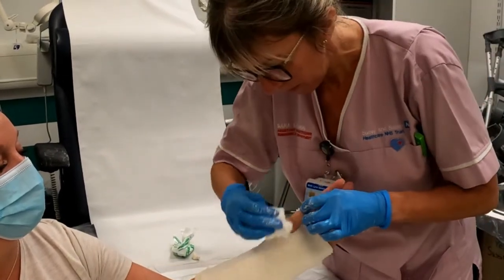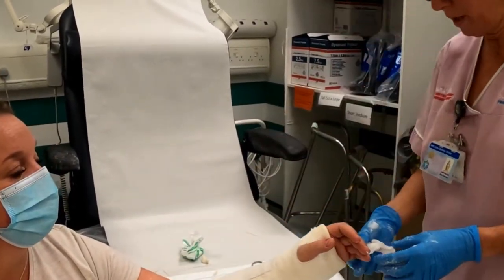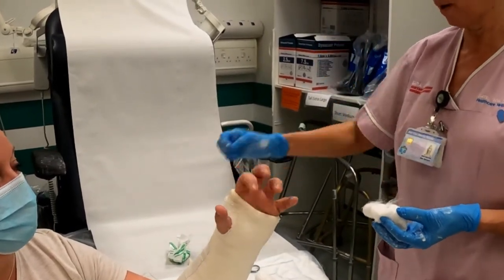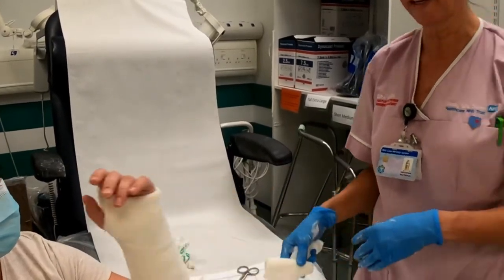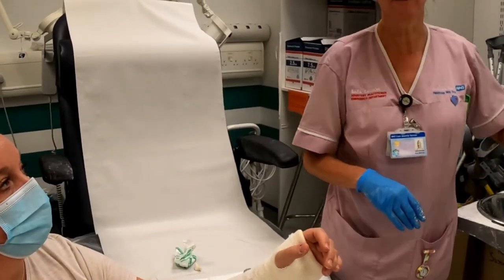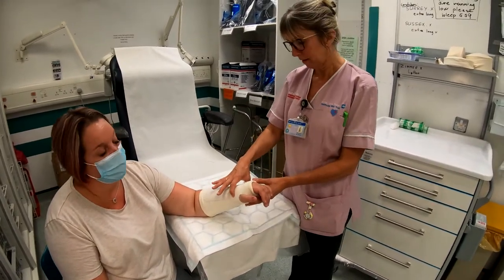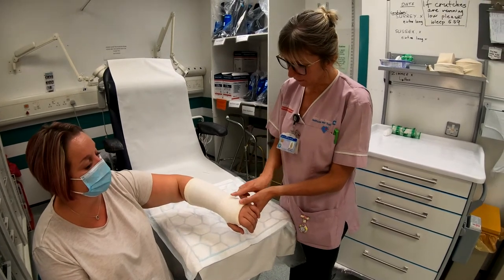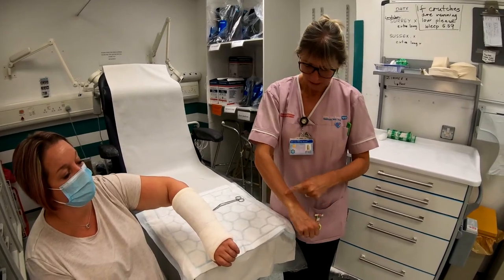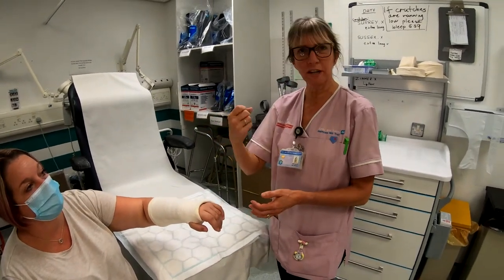Clean your patient up ready to put a sling on. Remind the patient to move their fingers regularly — it's good exercise at home — and move the elbow too. They should not wear the sling at night but during the day, just to ensure you don't get swelling into the fingers. Also ensure that when you cut out your plaster of Paris for this slab, it does come past the ulnar styloid — the knobbly part of the wrist — so that if there's any slight rotation in the plaster it's not going to rub against the styloid.